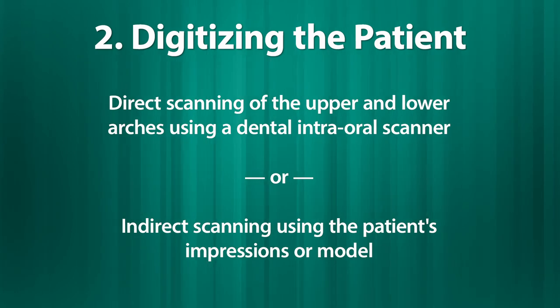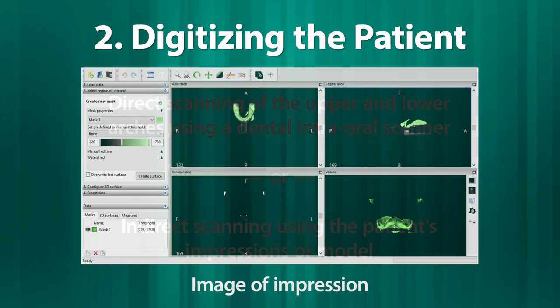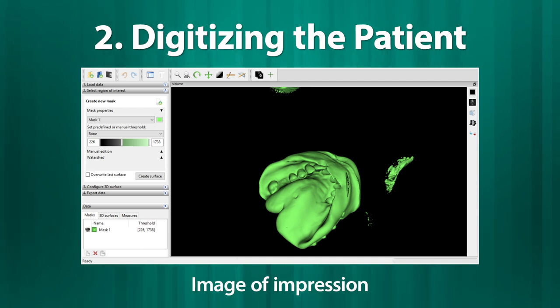If you don't have intraoral or extraoral scanners, you can perform a CBCT scan for the patient impressions. And then the DICOM files can later be exported as STL files using some of the freely available software. However, the accuracy might not be as good as performing a direct intraoral scan.